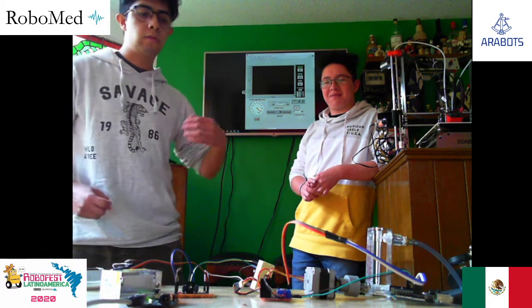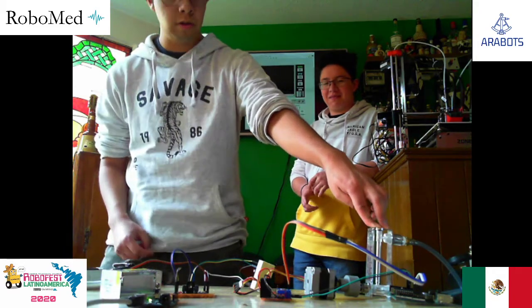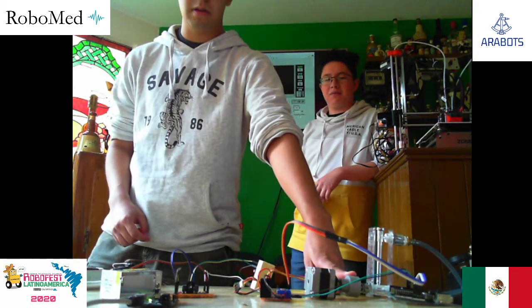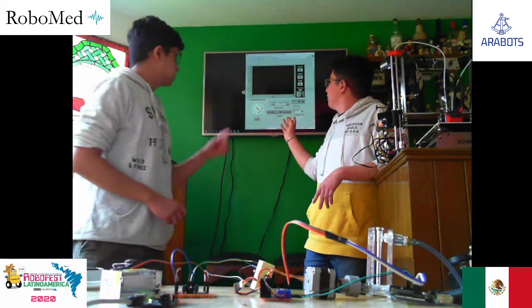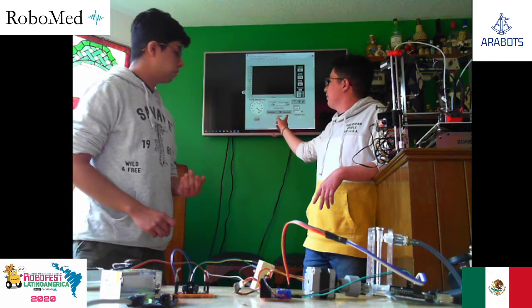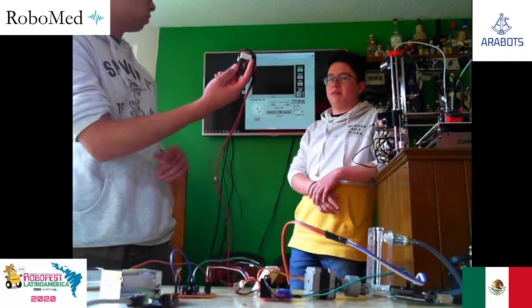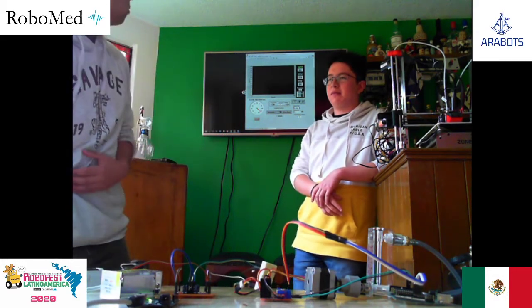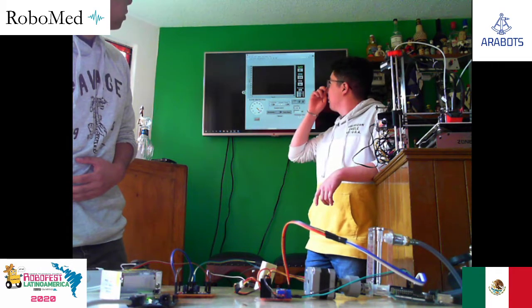And now, to control the oxygen supply, we use a flow meter that is used in oxygen therapy treatment, and we control it with a step motor. We join it with 3D printing. Now, we work in two ways, simulating or with real data. With the real data, we can see the parameters that it's getting with our handcrafted oximeter, and with the simulation, we can see how our device works.